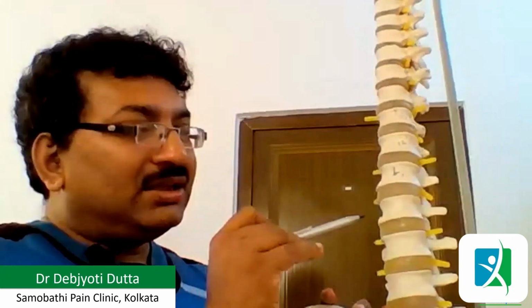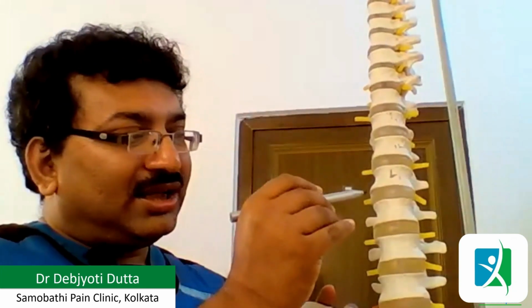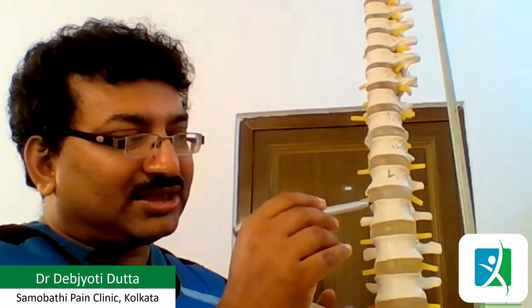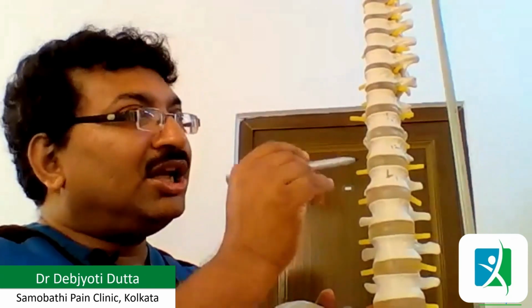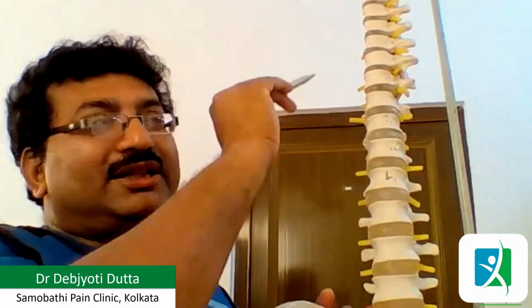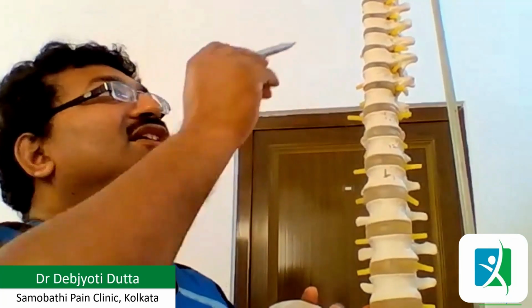So, in this area, as in the class on the anatomy of the sympathetic nervous system, the sympathetic chain starts slightly towards the posterior side, like in the stellate, where you give the injection at the junction of the transverse process and the vertebral body.